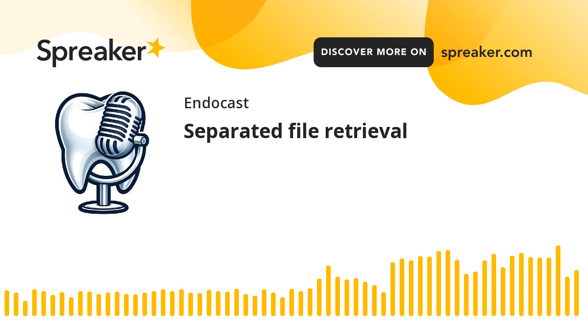So at the time of using ultrasonics to pull the file out, we need to protect other canal orifices. Exactly, the file coming out from the canal, jumping, popping. So we need to protect other canal entries. So if the file jumps, it will remain in the pulp chamber. It will not fall into any other canal. For sure, if it falls in any other canal, it will come out easily also. But we don't like that, especially if you have a canal with an open apex or a very wide canal, it will stay down there. So protect the canals at the canal entrance while you're doing ultrasonic retrieval.